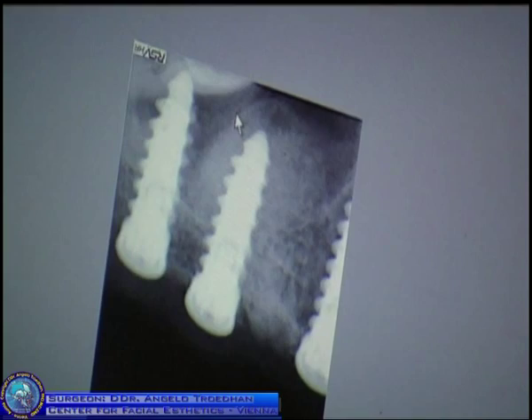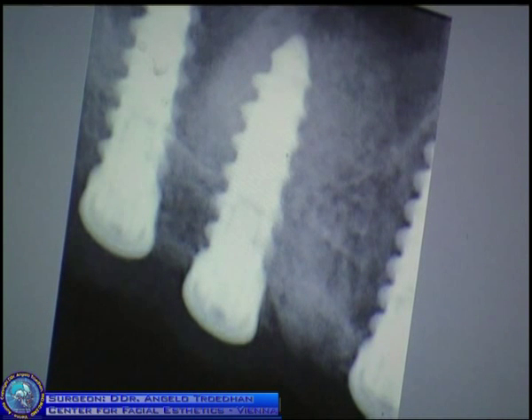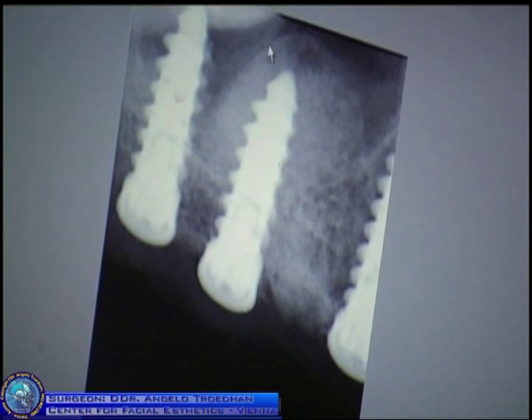you see here a slight line. And here we have to estimate the second dome. Because you always have to think that when we insert the implant, we still distribute the bone material to the side and to the top.